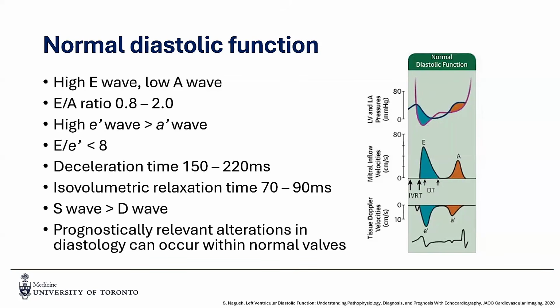If we look at the pulmonary vein flows, we see that the S wave is going to be significantly bigger than your D wave. The reason for this is that, as we remember, your S1 wave is predominantly determined by the relaxation of your left atrium. And so if your left atrium is able to relax strongly, then we have a pulling force that pulls blood from your pulmonary veins into your left atrium. And for the S2, we also have a very high E wave, but a correspondingly high S2 wave as well. And the D wave represents the E wave, and so has less contribution compared to the S wave.